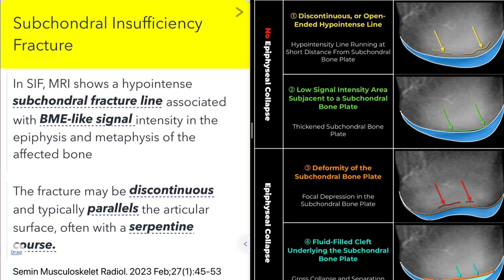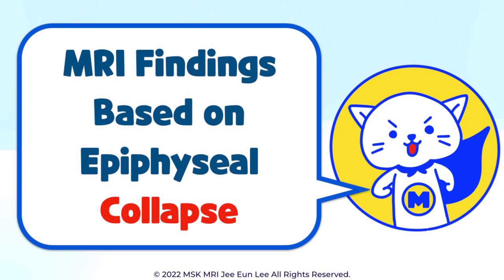On MRI, we typically see a hypointense subchondral fracture line with a marked bone marrow edema-like signal intensity in the epiphysis and metaphysis of the affected bone. These fractures may be discontinuous and generally parallel the articular surface, often following a serpentine course.